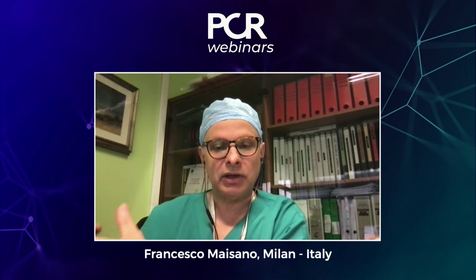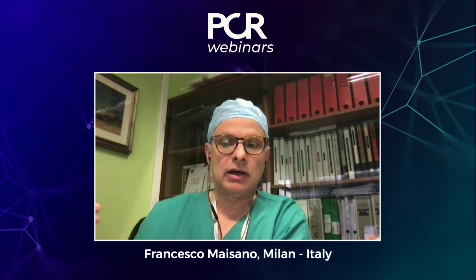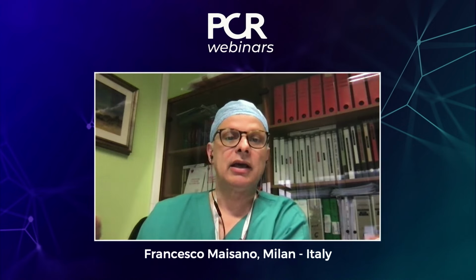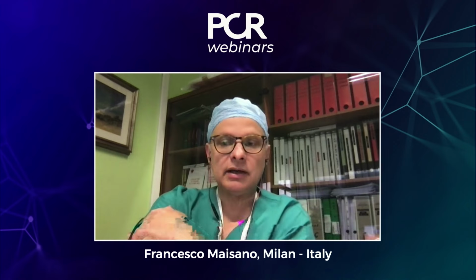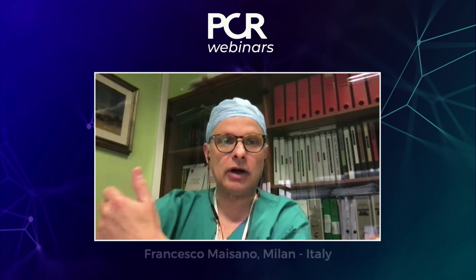to be underlined in this webinar, because again, we're talking about best practice, but also we're talking about avoiding all the potential complications of TAVI in a patient who is otherwise operable. So I think it's very important to go for the best to reduce the risk. So I told you, we need 4 points. No patient-prosthesis mismatch, which I think you achieved with a large valve, as we have seen in your data.